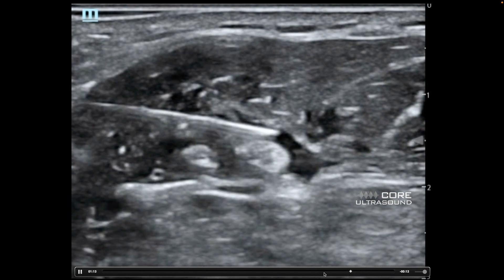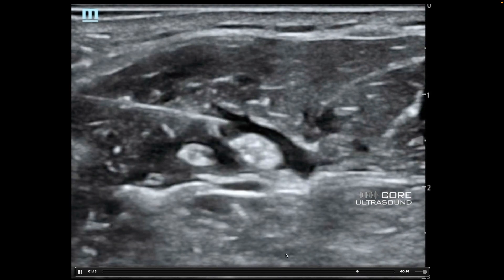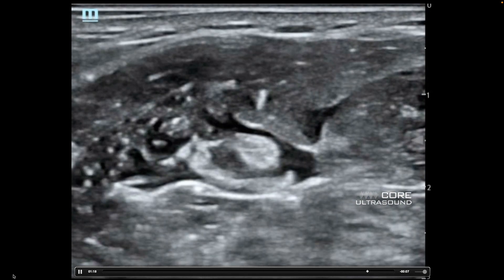Fast-forwarding a bit, you can see I'm getting a nice donut all the way around that nerve. You don't have to do a donut per se — if you just put it on one side, the anesthetic will diffuse through. But for faster onset, I'd highly suggest getting a donut. Usually what I do with the forearm ones is go deep first, inject about half deep, then back up, redirect, go more superficial, and go on top to create that donut versus just putting it on one side — what I'd call the croissant approach.